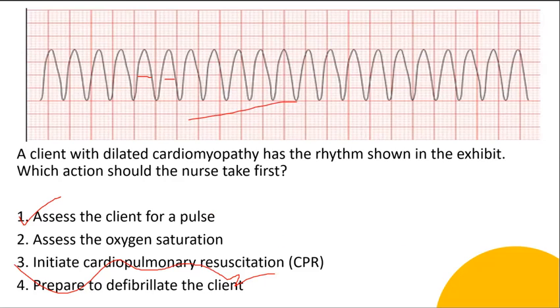So remember, for ventricular tachycardias with a pulse, if we assess this patient and he has a pulse, we need to further assess for clinical stability or instability. You need to look out for signs of instability like hypotension, altered mental status, signs of shock, chest pain, acute heart failure. Because if the client is unstable and he has a VT with a pulse, usually we treat them with synchronized cardioversion. So remember, synchronized cardioversion for unstable tachycardias with a pulse, very vital for the NCLEX.